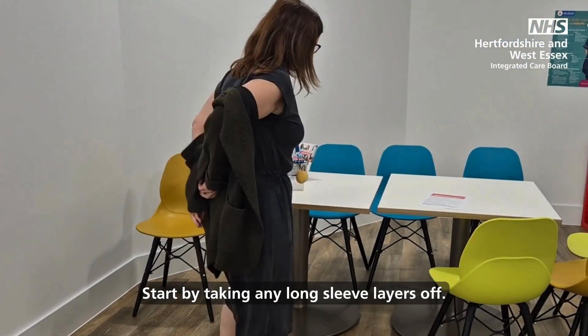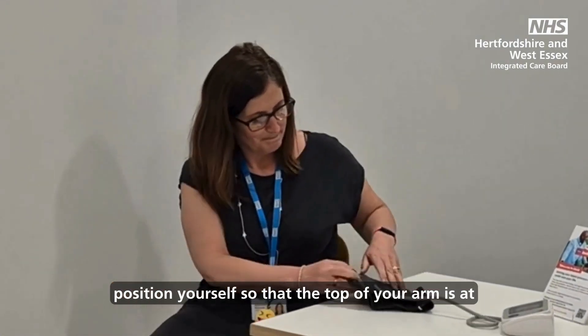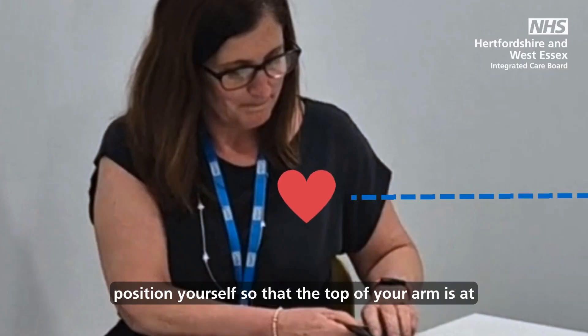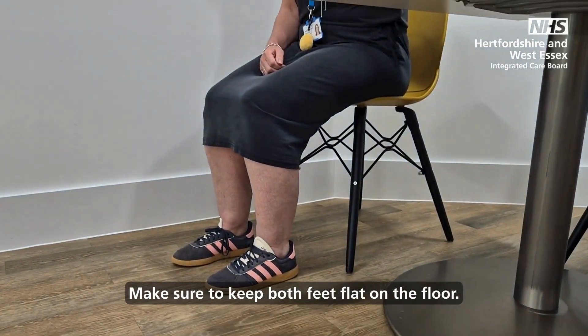Start by taking any long-sleeved layers off. Sit on the chair with your arm on the table and position yourself so that the top of your arm is at heart height. Make sure to keep both feet flat on the floor.